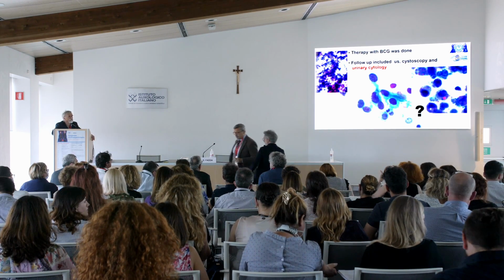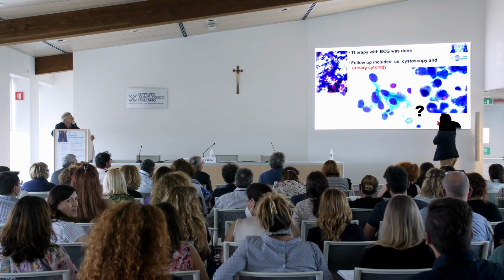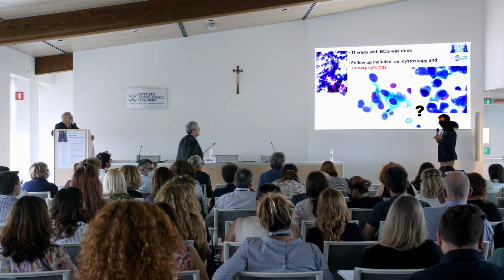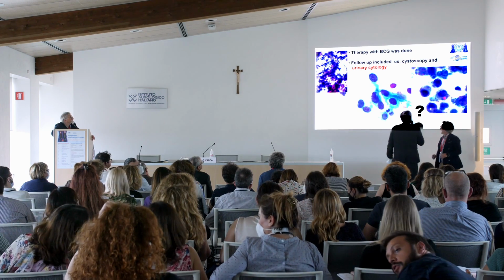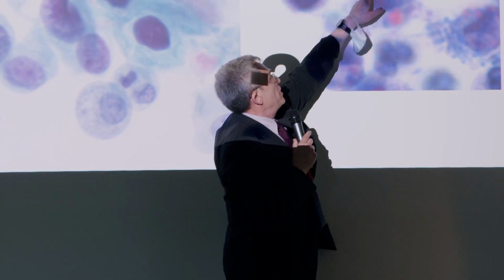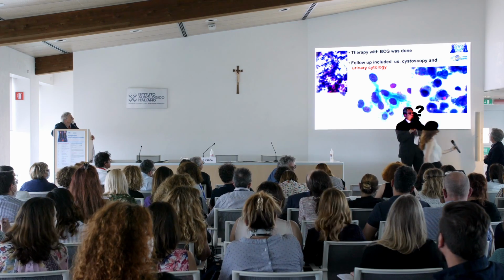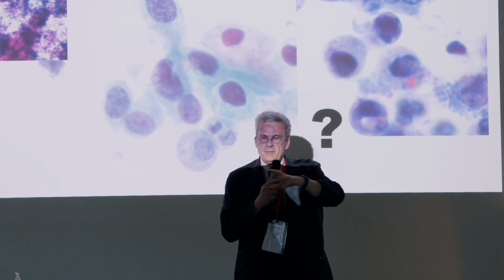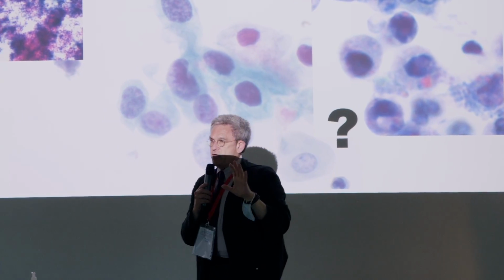Another feature, just to ask Professor Vielh. This feature, in my opinion, is a mucus. It's possible. This is a kind of combination of what you have in cytoplasm of the other cells. These are degenerated features that you can see in the nuclei. And I agree with my colleague that all these cells are probably only degenerative.